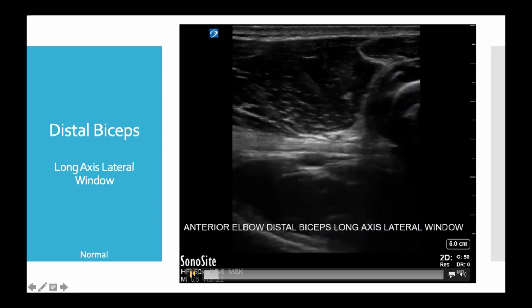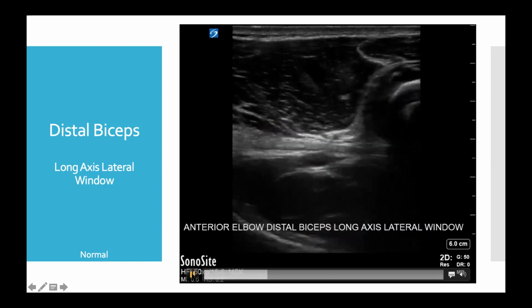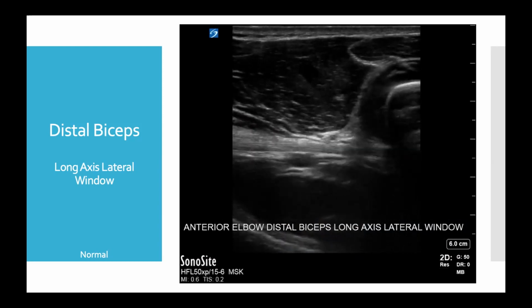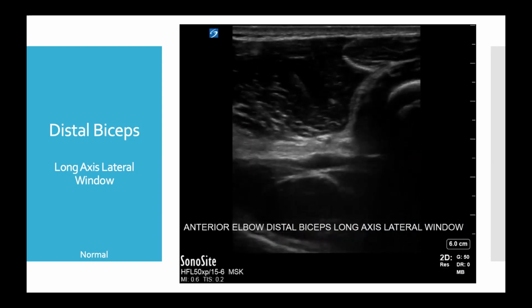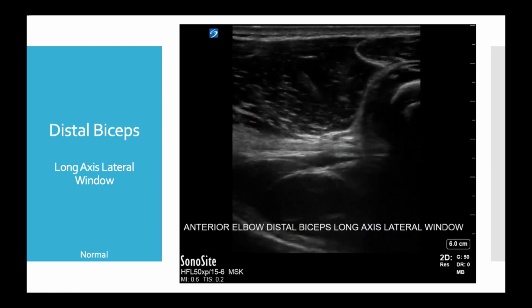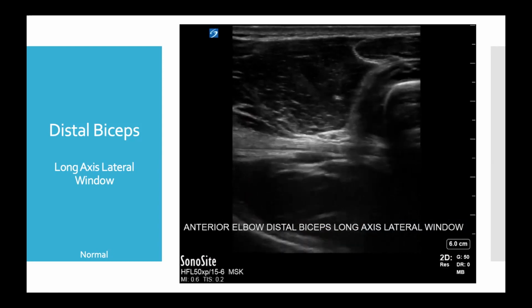And if we play this, as the patient supinates, we can see tension building on the biceps tendon, which would indicate that the tendon itself is in fact intact. I'll just play it one more time.